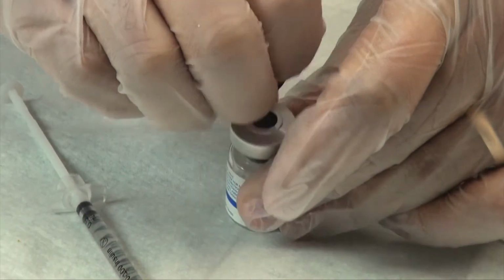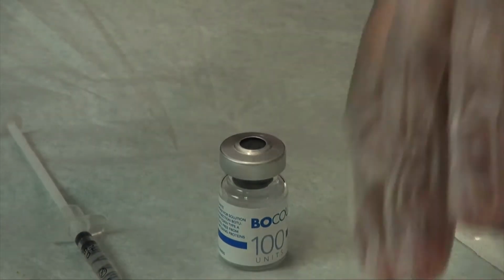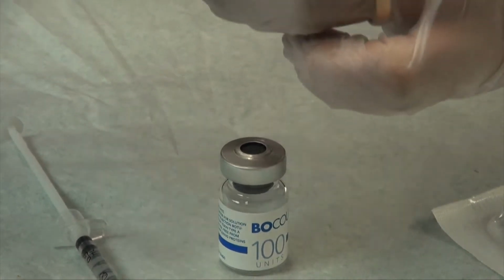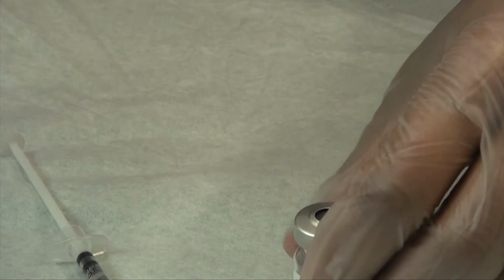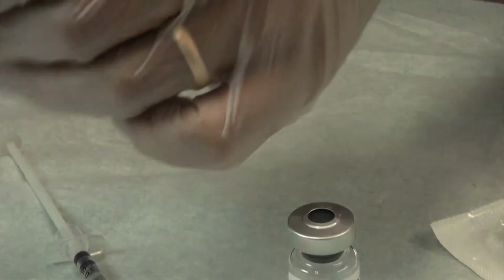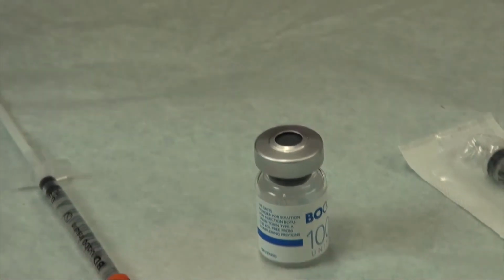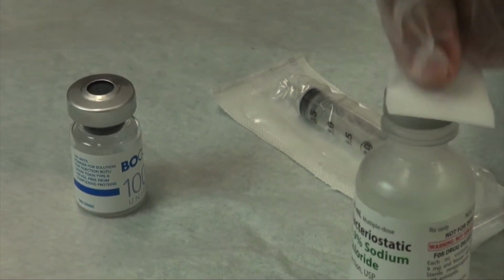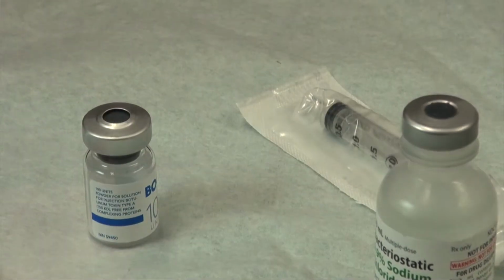In reconstitution terms, we'll remove the blue stopper. Again, I shall take a 21 gauge needle and we shall swab both the vial of saline and the vial of toxin.